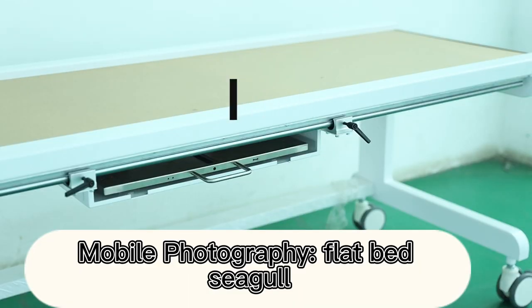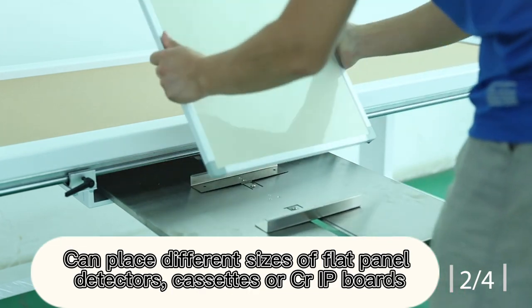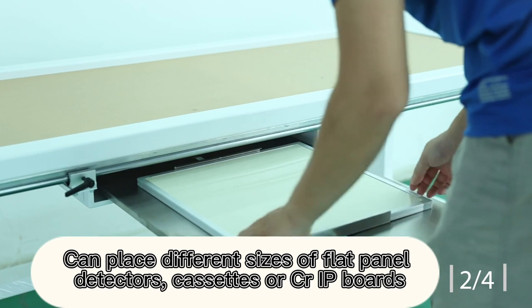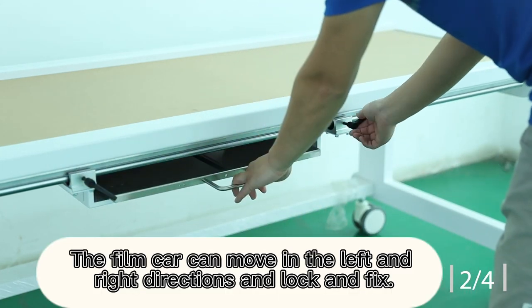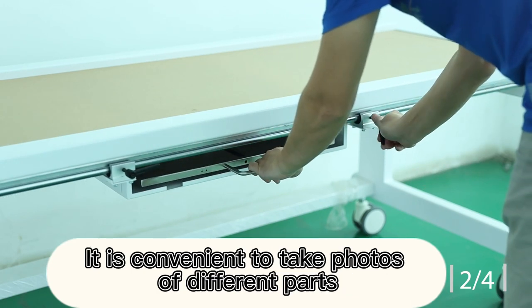Mobile Photography Flat Bed — Seagull Photography Flat Bed with film box can place different sizes of flat panel detectors, cassettes, or CR IP boards. The film car can move in the left and right directions and lock and fix, making it convenient to take photos of different parts.